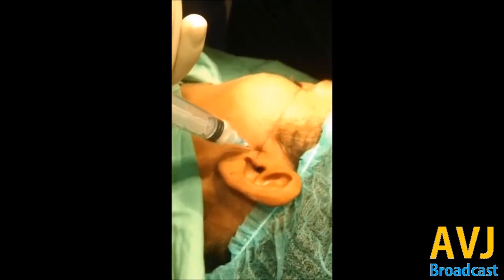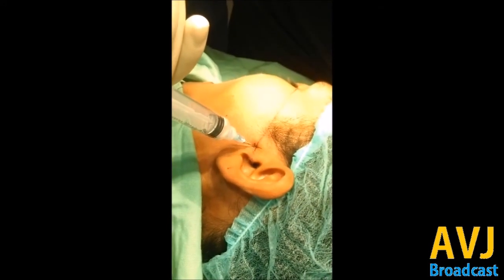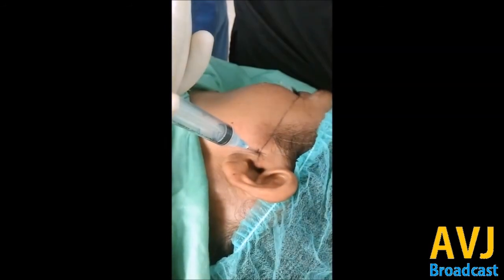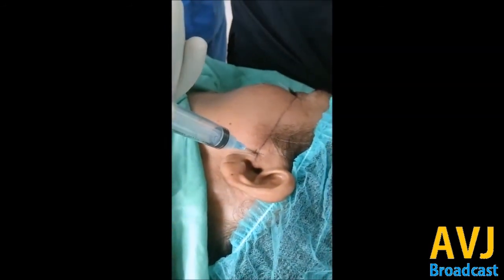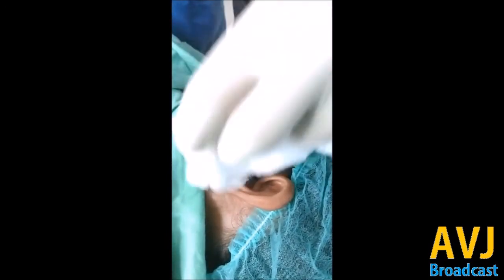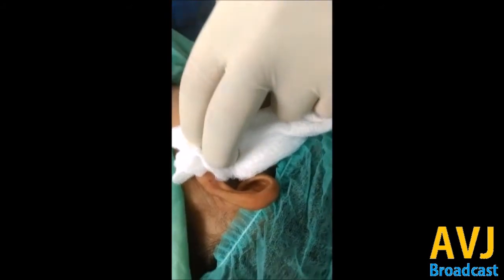1.8 ml is the exact volume of the superior joint space — do not inject more than that. If you have not given any auriculotemporal nerve block, then local anesthesia should be mixed inside the steroid. This is how it goes — pretty easy but a little technique sensitive.